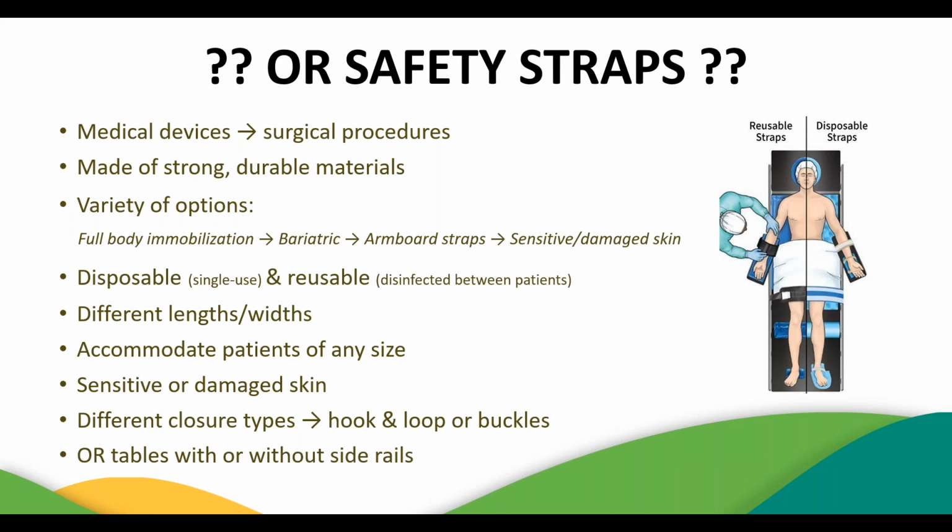I just realized about a month or so ago, they have something specific just for the hand table, which I find actually great, because it's such a great idea. And I'm advocating for it: well, we don't have a hand table. No, fine, you don't have to switch them out. We have a Trios OSI. Okay, yes, the same thing. Exactly. But what I'm saying is, I never saw that. Right. And I was like, that's an idea, because it helps you with moving the patient besides restricting the patient from moving.